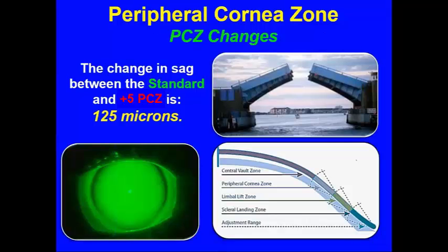That lens adjustment is simple. It is just simply communicating to the consultants at Art Optical that that area, the peripheral corneal zone, needs to be heightened. And they will then change that peripheral zone 5 degrees up, just like a drawbridge, increasing the clearance in that peripheral zone.